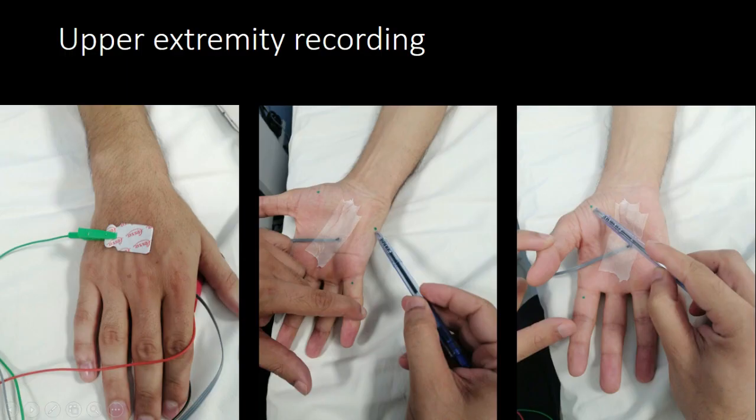Okay, then comes the temperature probe. I tend to keep the temperature probe on the palm. Also, you can have it on the dorsum of the foot or the plantar surface of the foot to keep the temperature probe. This is something very important, and it's a big thing when we talk about nerve conduction studies, especially demyelinating polyneuropathy studies. Then the way I tend to do it, I mark the areas where I'm going to put those recording and reference electrodes. Not reference particularly. Reference, remember, is generally 3 to 4 centimeters distal to the recording electrode.